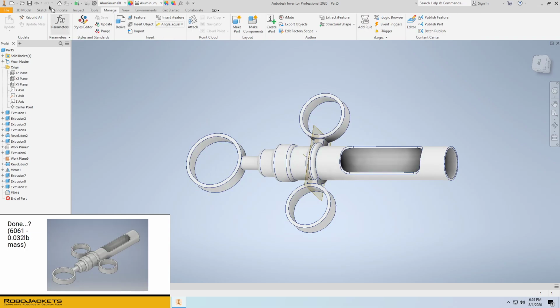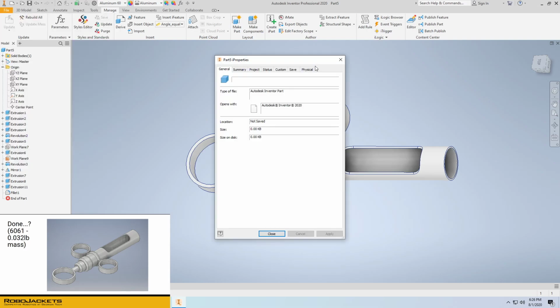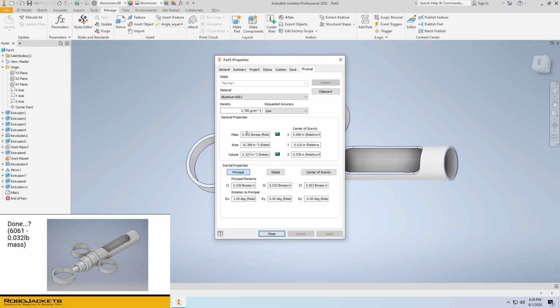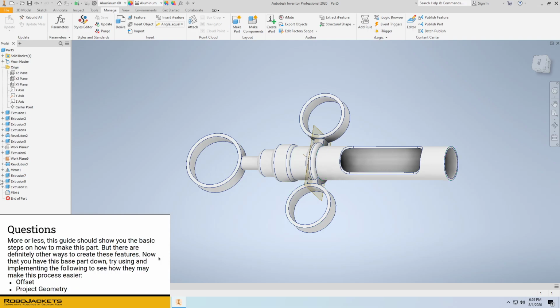And to check your work, we'll go to iProperties, go to Physical, ensure that your material is set to aluminum 6061, and your mass should be 0.032. If that doesn't line up, go back and look through your steps again to make sure that you did it right. If not, you're good to go.